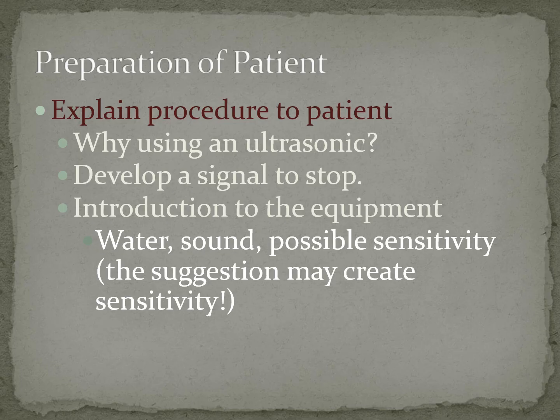Okay, but don't say things like, oh, it's possibly going to be sensitive, or this is probably going to hurt, or you might not like this. So don't put negative thoughts in their head. Just say, I'm going to use this instrument. It vibrates, it squirts water. If you need to take a break, please raise your hand for me. Okay. So like I said, just explain to them all that is going to happen.